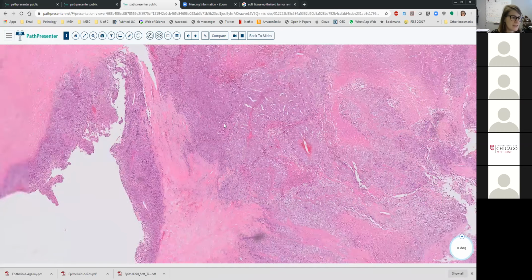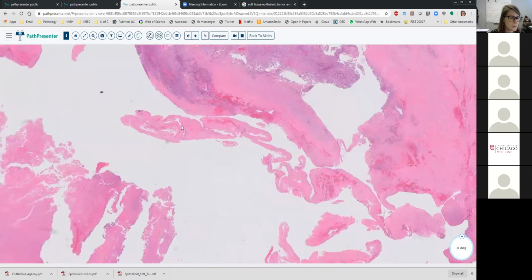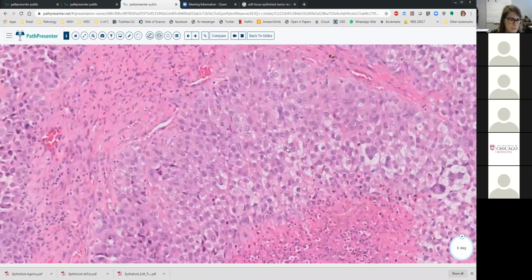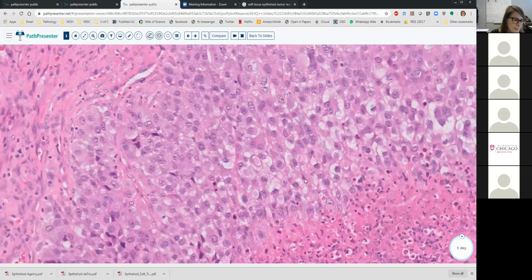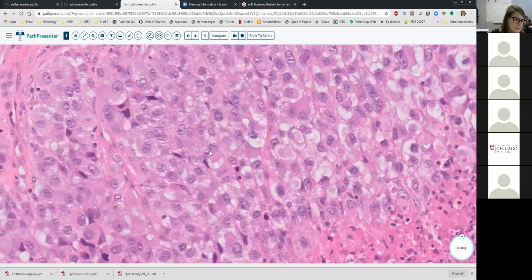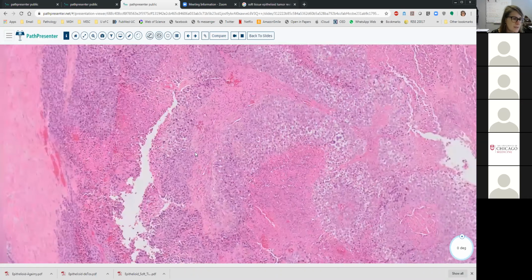And so this is a deep tumor that's also very necrotic, somewhat hemorrhagic. I don't see necessarily extravasated red blood cells, but I do see maybe focal eccentrically placed nuclei with eosinophilic cytoplasm, and necrosis.